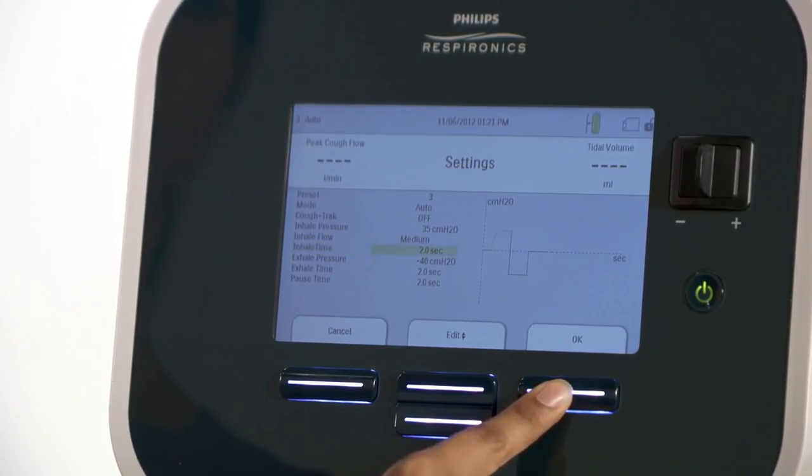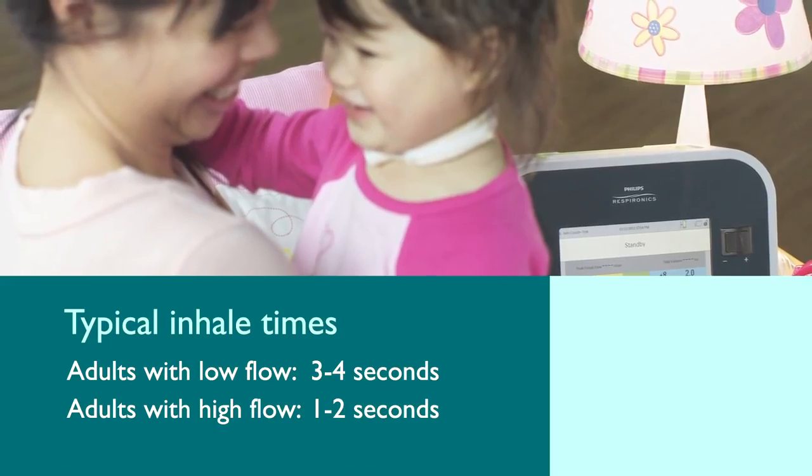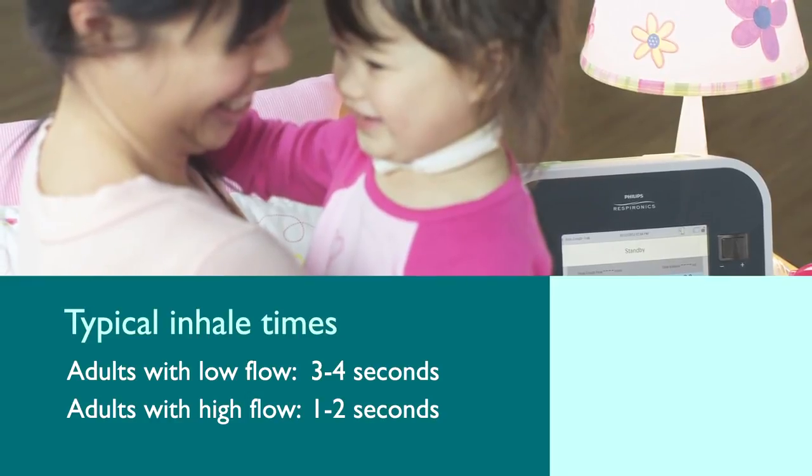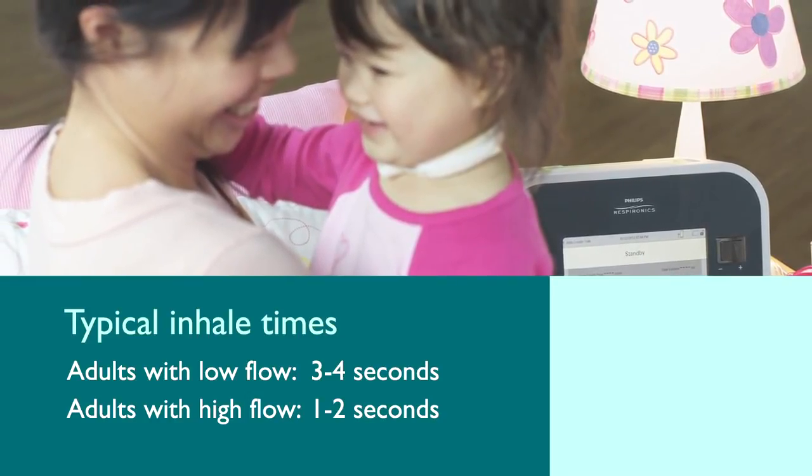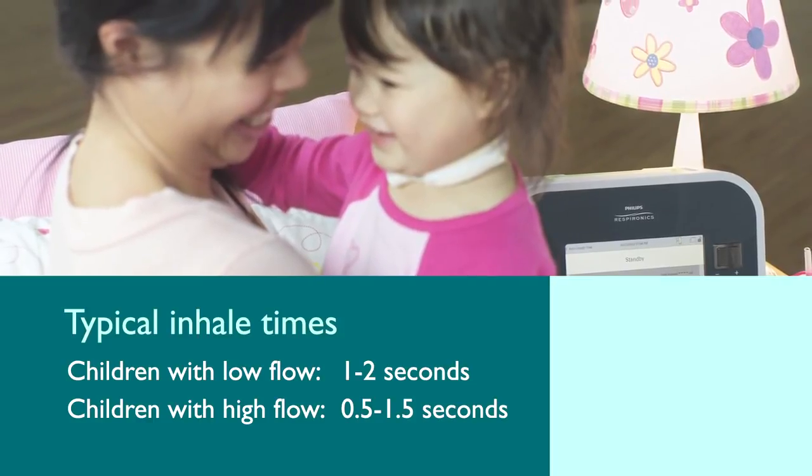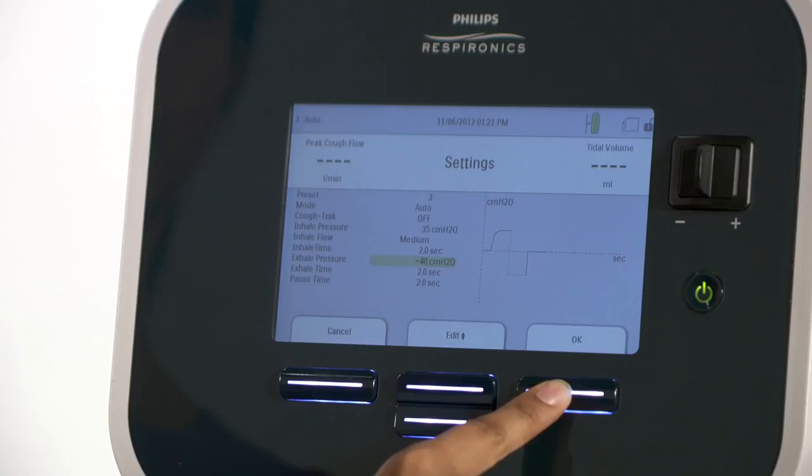Use the right button under modify to highlight inhale time. A typical inhale time for adults with a low flow setting is 3 to 4 seconds, 1 to 2 seconds in adults with higher settings. For small children with low flow, 1 to 2 seconds is typical, 0.5 to 1.5 for high flow. OK accepts the new inhale time.